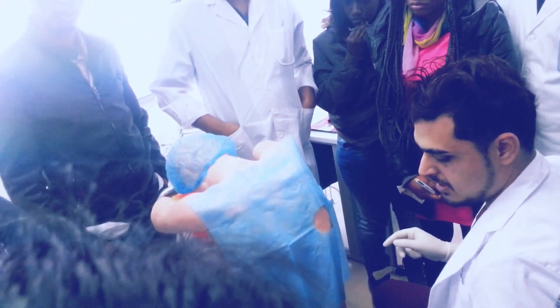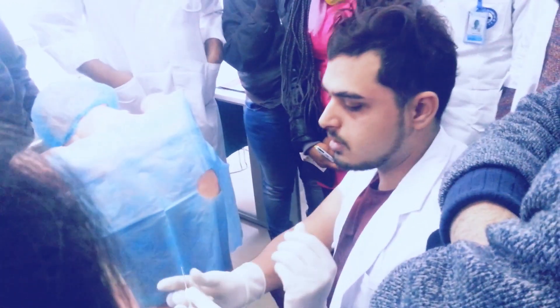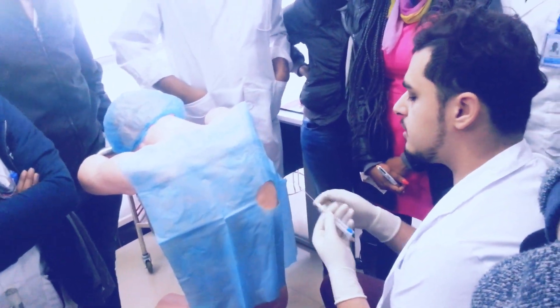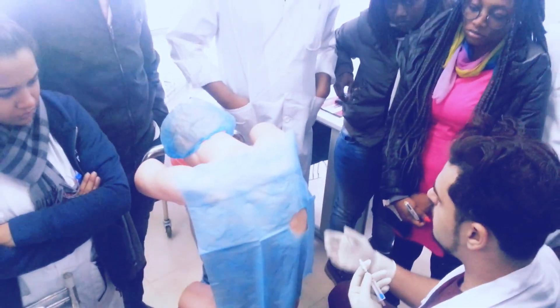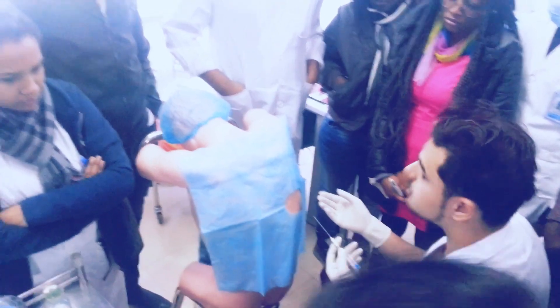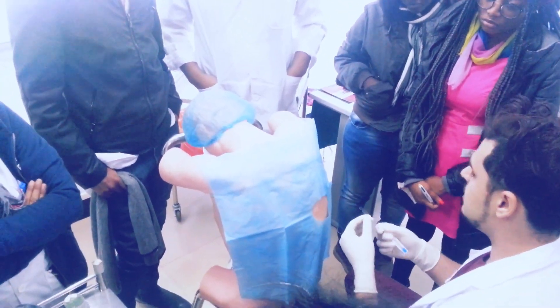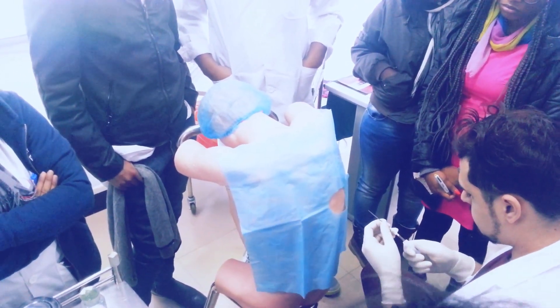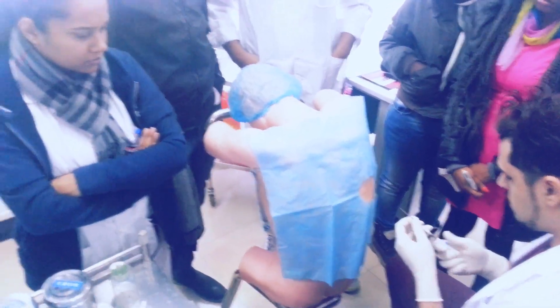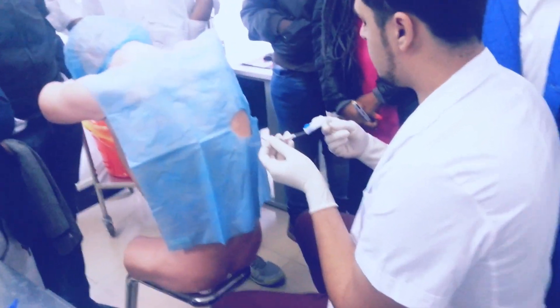After that, you must dispose of this in the yellow bucket. After this, for the needle part — if the patient is fat, you will use the long needle. Because this dummy, our patient, is skinny, we will use the short needle. Before using, please make sure this one is closed. You must close it, because if you don't, pneumothorax may happen — air will go in.